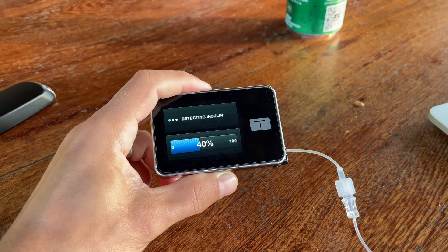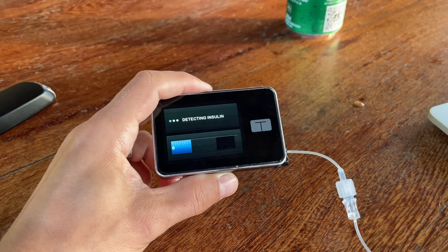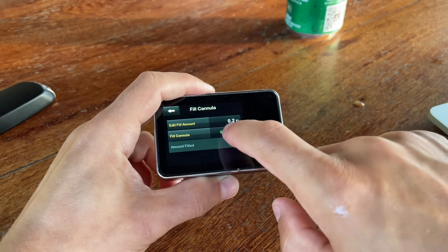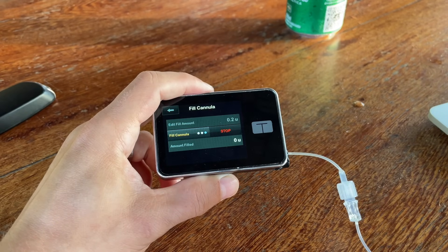Another thing I don't love about the site change process is the fact that it takes a lot of steps and confirmation screens. It's quite time-consuming, and it happened to me a few times that I forgot to confirm the last screen — when that happens you need to refill the cannula again and basically start from scratch, which leads to even more insulin wasted.